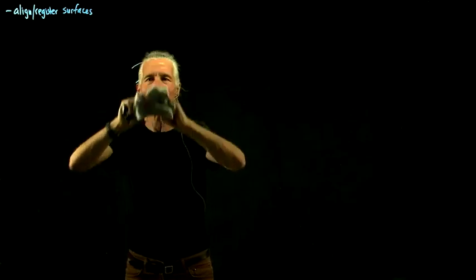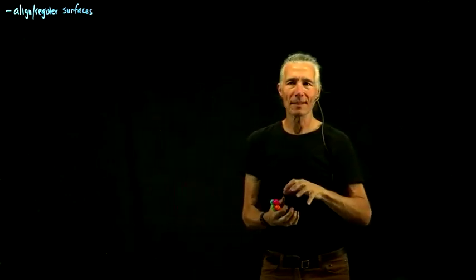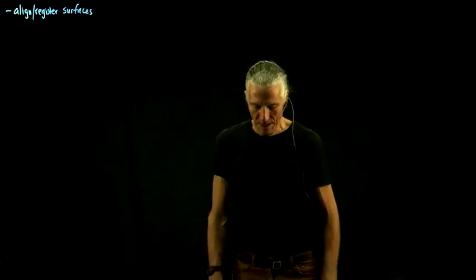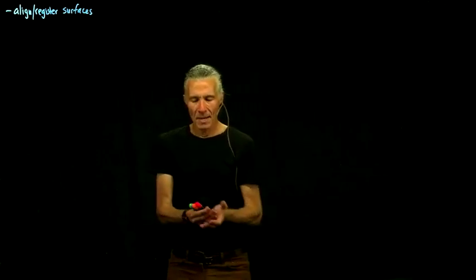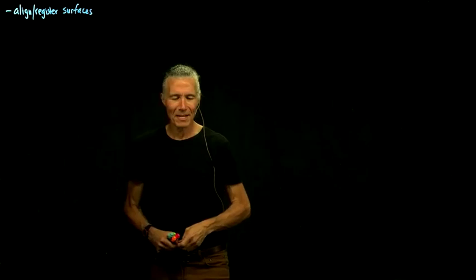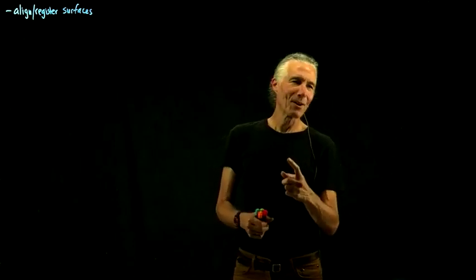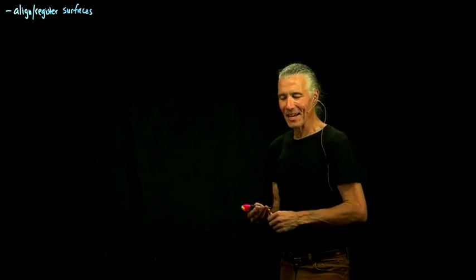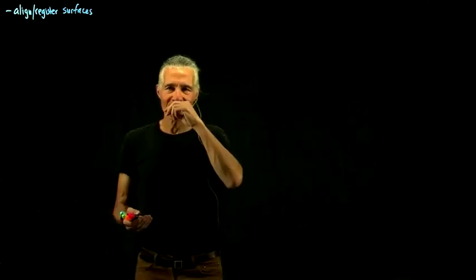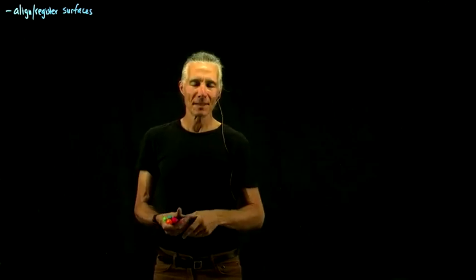And so the idea is if we could somehow align brains using the surface instead of 3 dimensions, we would do a better job. And so we got the idea of how to do this years ago, like 25 years ago. I always like to say it was Anders Dale, who was my student at the time, who wrote most of the software, and basically added one line of code to do this. And what that one line of code was, was to essentially try to determine where the sulci were on the surface.